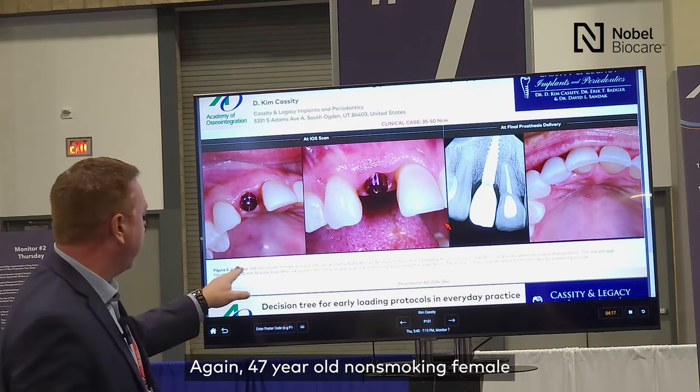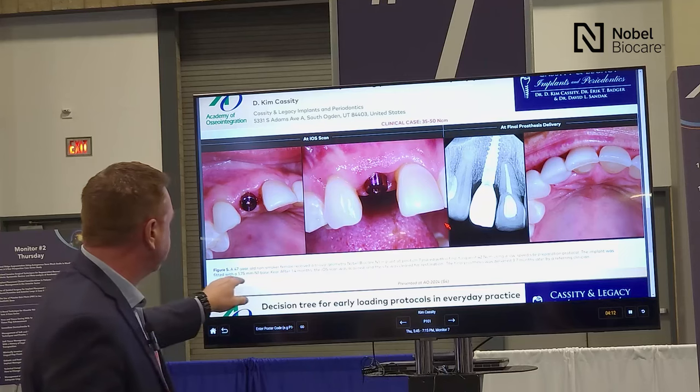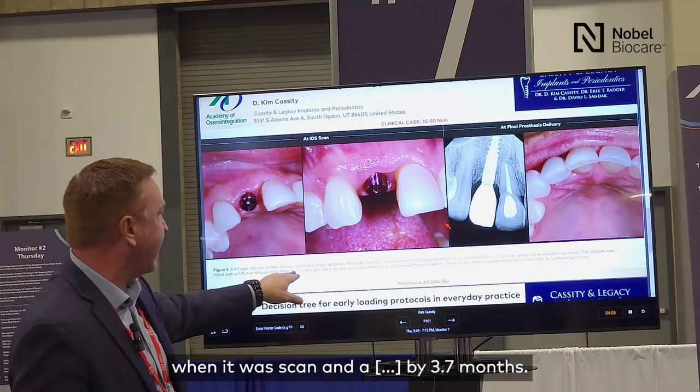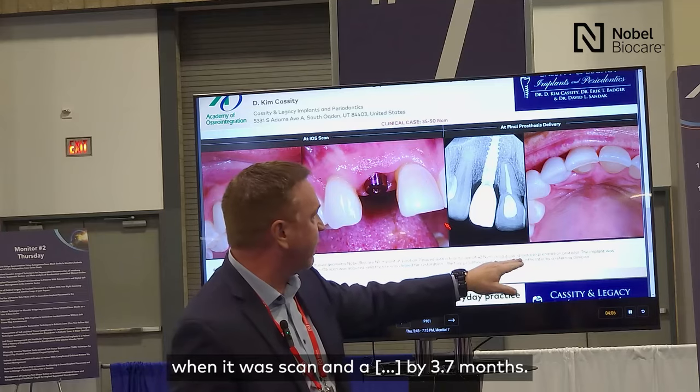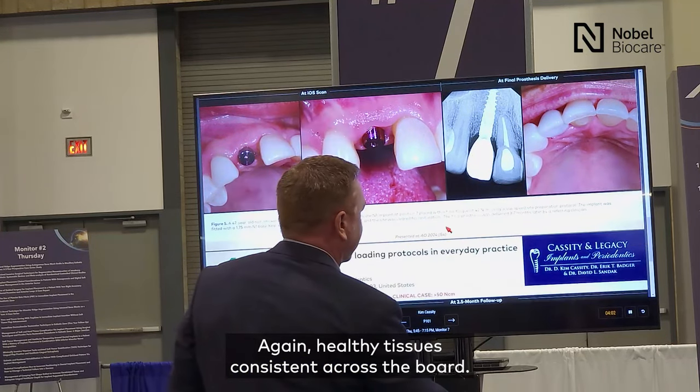A 47-year-old non-smoking female, 42 newton centimeters insertion torque, N1 base placed. Scanned at 1.4 months and restored by 3.7 months. Again, healthy tissues, consistent across the board. Great bone levels around our implants as well.